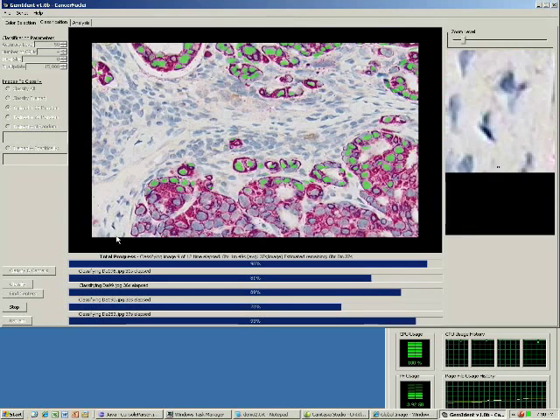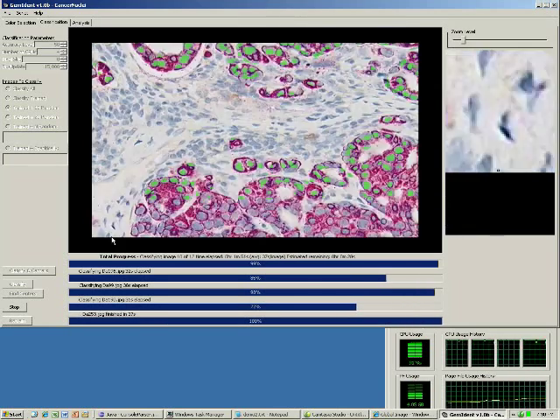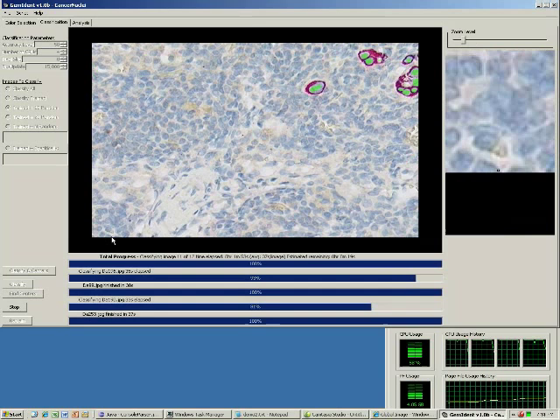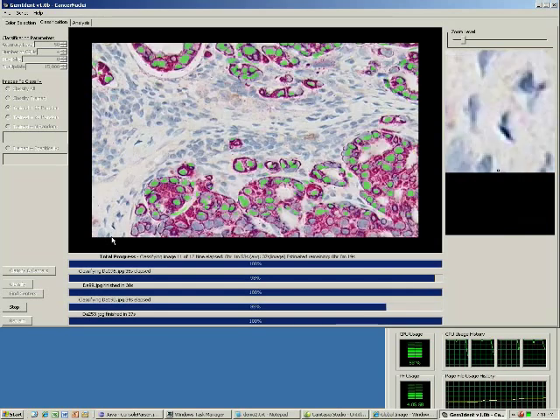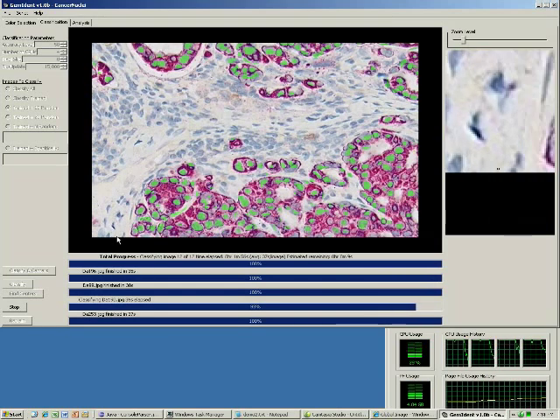The find centers button will do blob analysis to try and locate the centers of the cancer nuclei. This feature will be demonstrated shortly. Let's wait for the identification to complete.